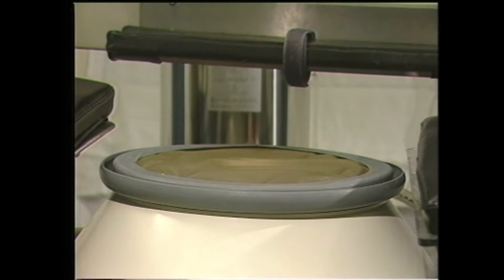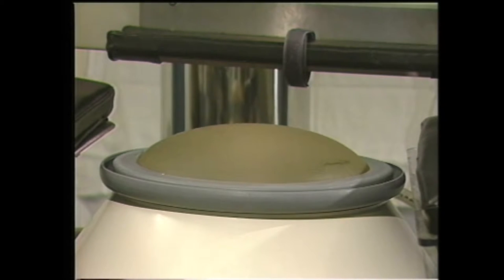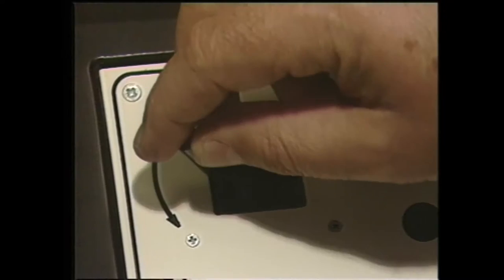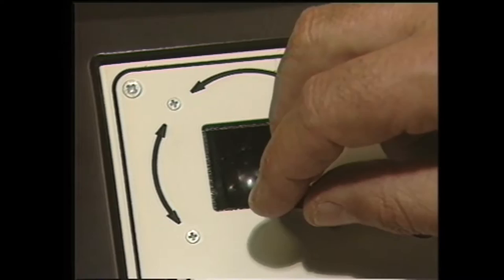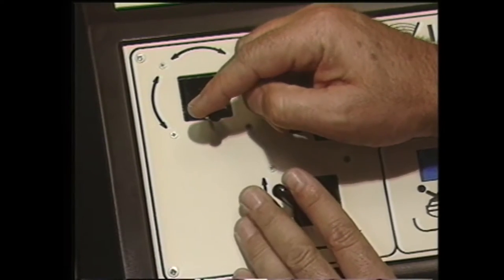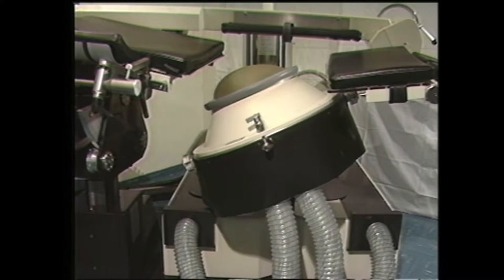Entre les deux éléments de la table se trouve le cône surmonté d'une bulle qui permet d'obtenir le contact entre la sonde ultrasonique placée au centre du cône et le patient. La possibilité de déplacer le cône dans tous les axes permet le repérage de la pierre quelle que soit sa position dans le système excréteur rénal.